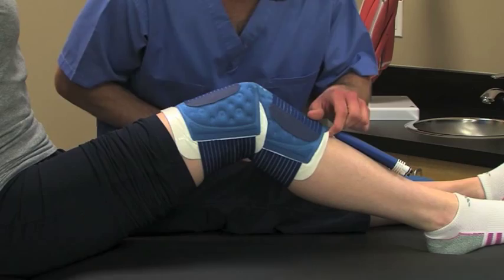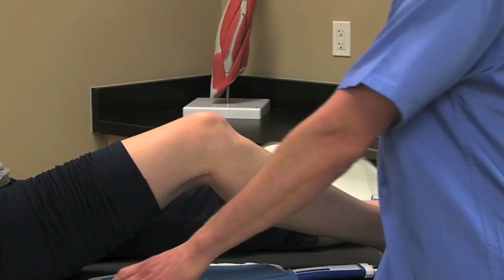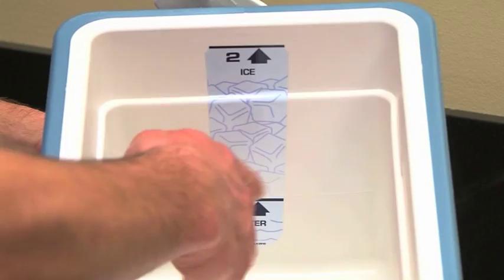If the patient is wearing a sterile dressing that doesn't completely cover the skin under the pad, use an additional barrier. With the insulation barrier in place, if using the PolarPad, apply with a smooth side up. When using a wrap-on pad, apply with a blue side up. Use the elastic straps to hold the pad in place. For information on how to properly apply a specific pad, watch the pad module that details your specific pad.